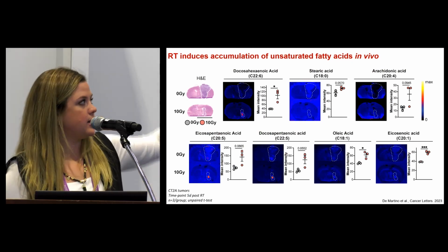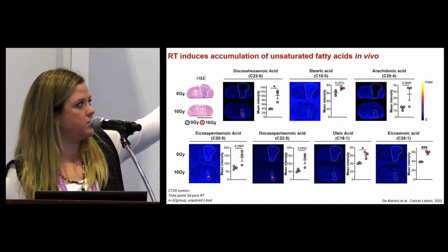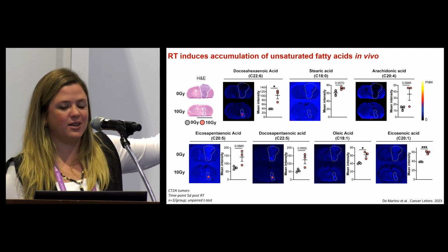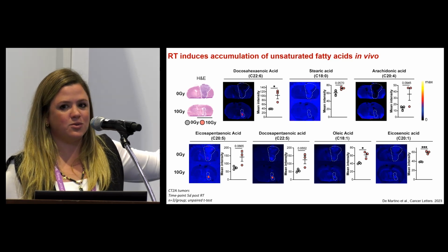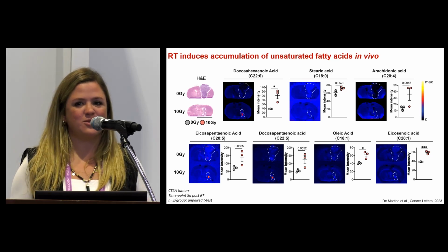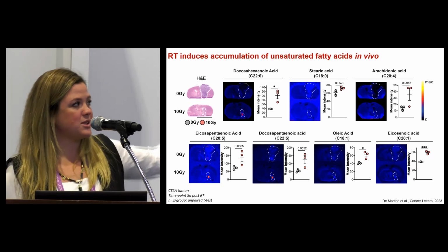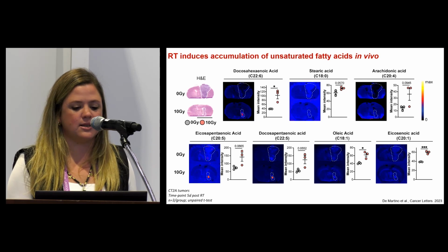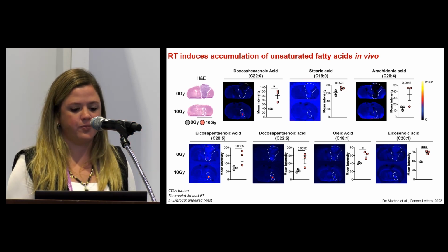And you can see here on the left the H&E. So the control tumor is, of course, bigger, the one on the top. And the treated tumor is smaller. And this is important because I think, especially for this symposium and for this workshop, that you see that in brain tumors, it's really hard to use other techniques such as flow cytometry, or even mass spectrometry isolating the tumors, because sometimes the treated tumors are so small that we need special techniques to characterize them, because they are really hard to dissect from the mouse brain.